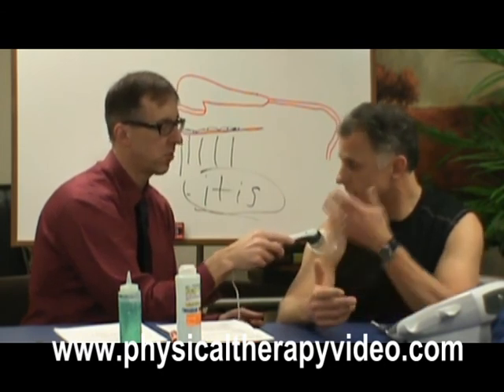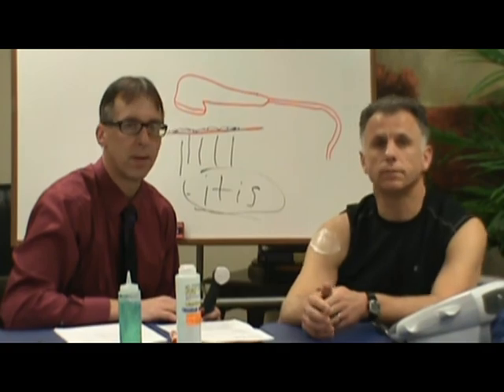Again, 7 minutes, probably at least 3 treatments to see if it's going to help. For most people, it does not help after 1 treatment. That's been my case. I very rarely have someone come back after the first treatment and say, oh, that was great. It's generally more like 3 treatments. But it should be totally comfortable, pain-free. Yep. Thanks a lot.